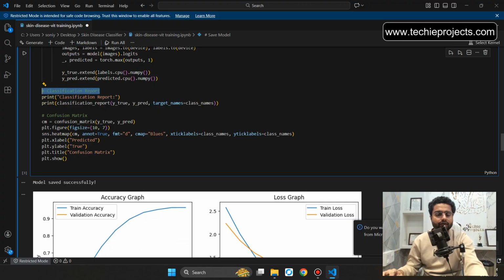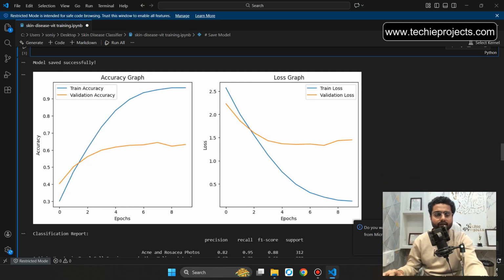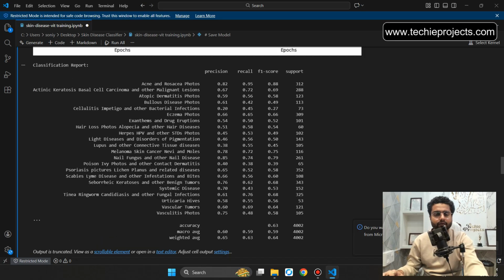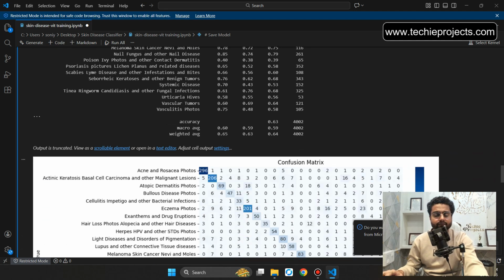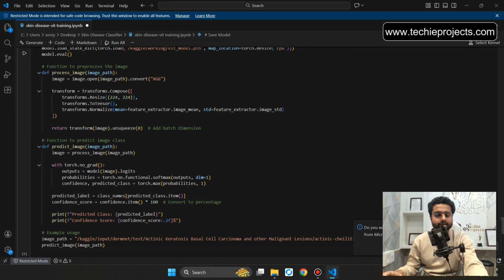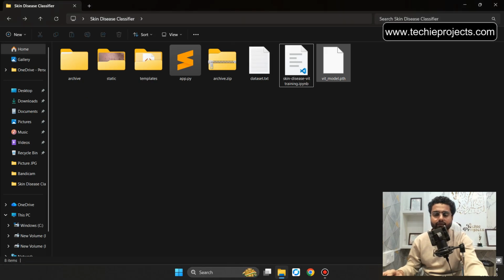classification report, confusion matrix. So it will generate the graphs, accuracy graph and loss graph, training accuracy and validation accuracy, training loss and validation loss. It will give the classification report, precision, recall, F1 score and the support with the different classes, confusion matrix. Now confidence score 98.90%. So let's close. This is the model which we have trained from that particular data set.